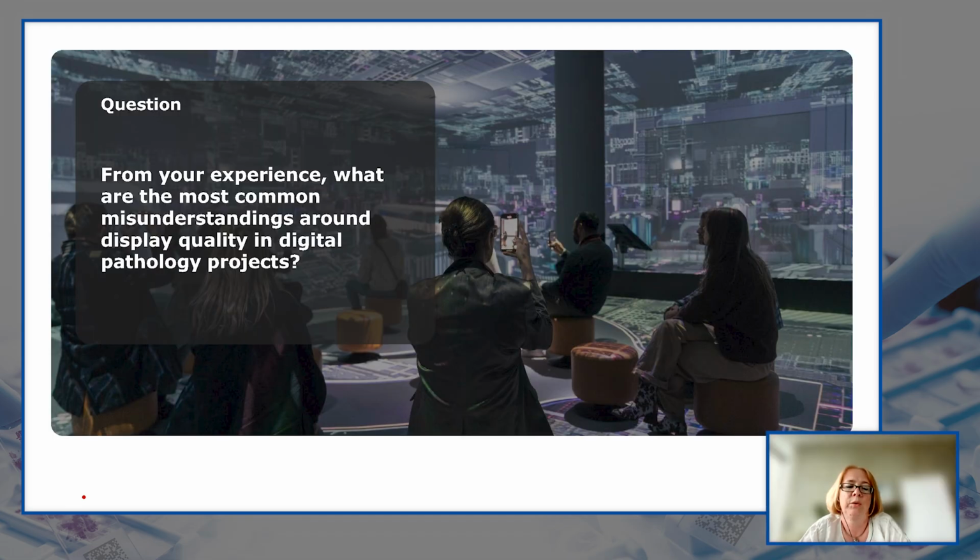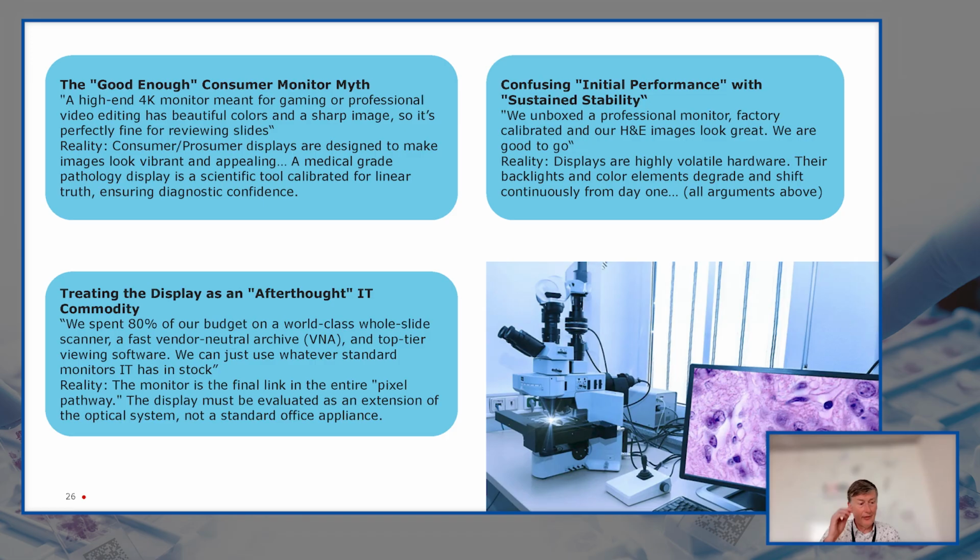Okay, and what do you think, what are the most common misunderstandings around display quality? Yes, I would like to highlight at least 3 of them. So first of all, a lot of people look at displays and assume that it's good enough. They buy an 8MP monitor, which is good for gaming, for example, because that has a high refresh rate, and it produces a nice sharp image.